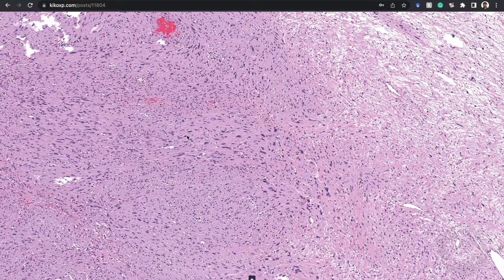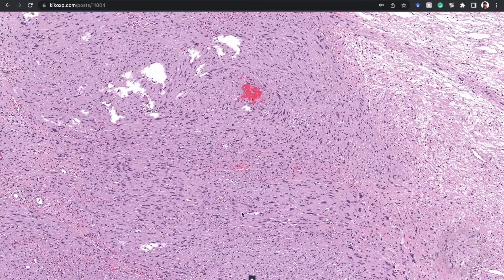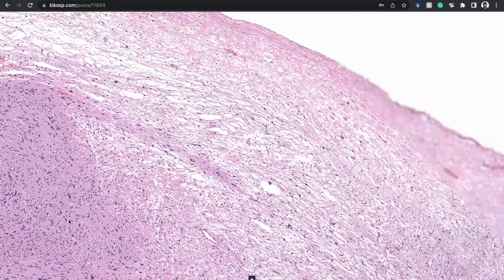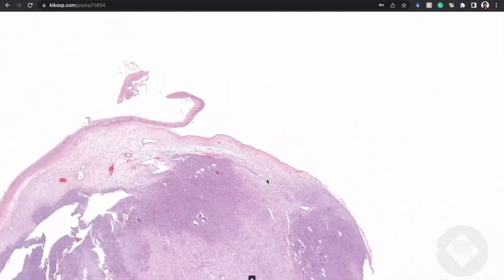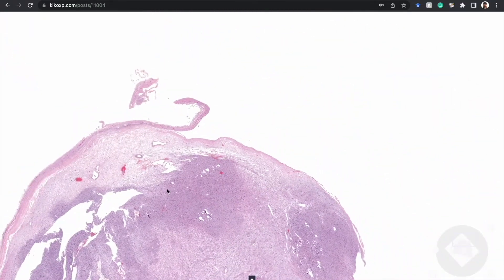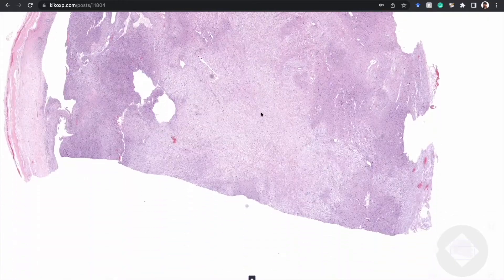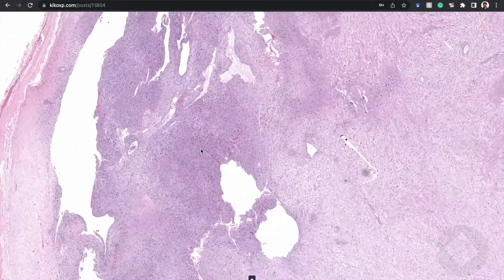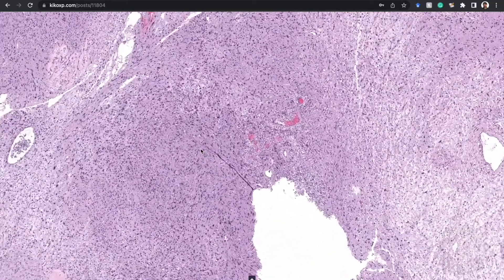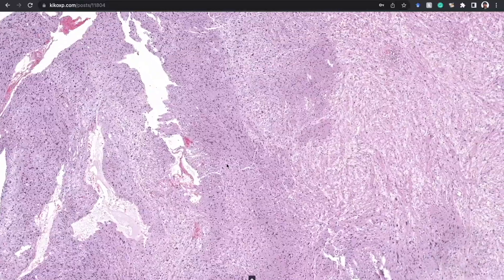Once you think it's schwannoma, you do an S100 or SOX10 — it's wall-to-wall strong positivity. Recognizing Antoni A and B, the capsule, the dilated vessels often with sclerosis around them — those are the key features. Then you can go look in the hypercellular zones and see if you find Verocay bodies.